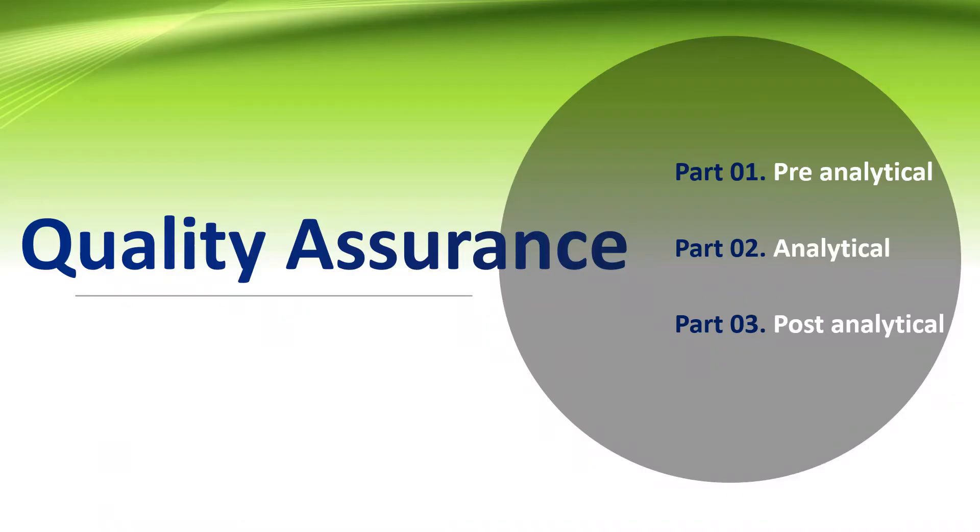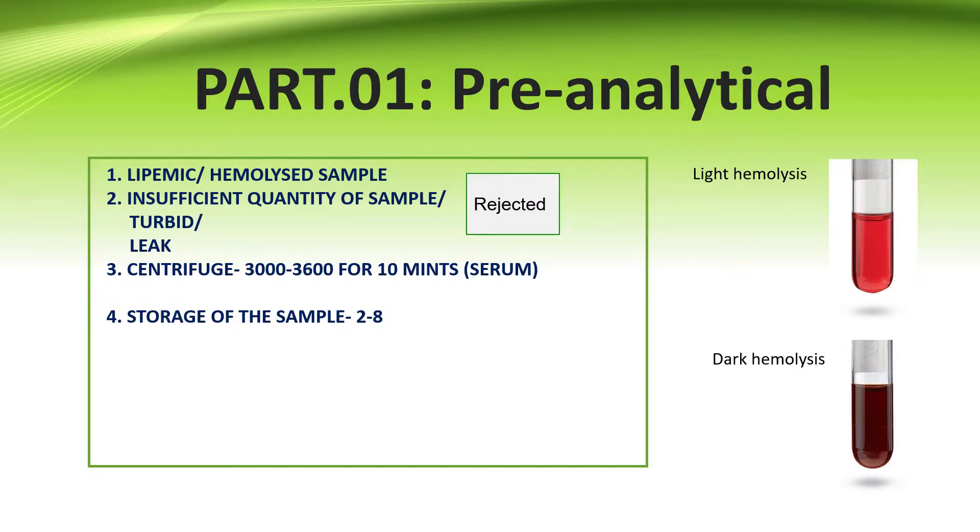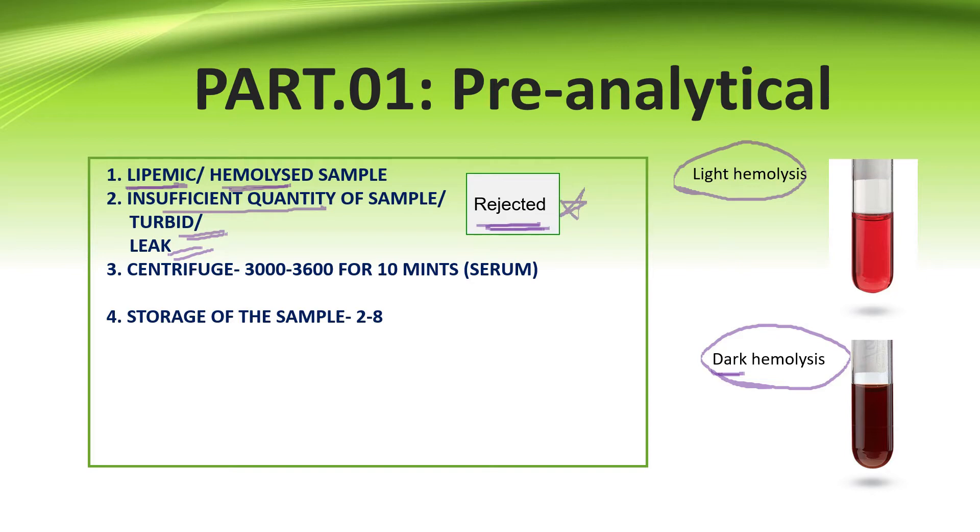Quality assurance in ELISA is divided into pre-analytical, analytical, and post-analytical parts. In the pre-analytical part, lipemic or hemolyzed serum — whether light hemolysis or dark hemolysis — is always rejected. If the received sample is insufficient, or any turbidity or leakage is noticed, it is always rejected.